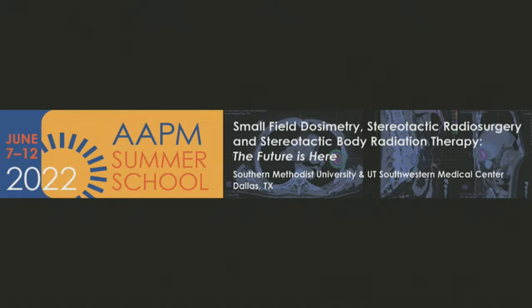For everything else, it's really manual fusion, like they would do anywhere else. So it's time-consuming. The dosimetrists play a big role in that. They're usually the ones who do the fusion, and then we review the fusion. And I think that's very common in other institutions too. Do radiologists sometimes get involved in peer review in some of this very subtle treatment? Yeah. Okay, thank you.